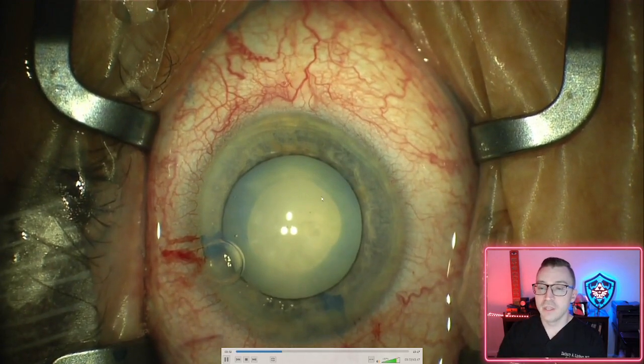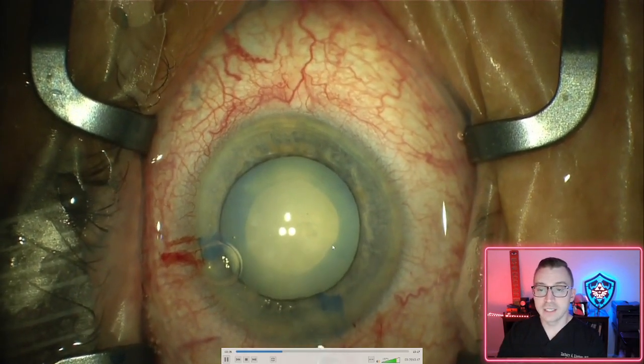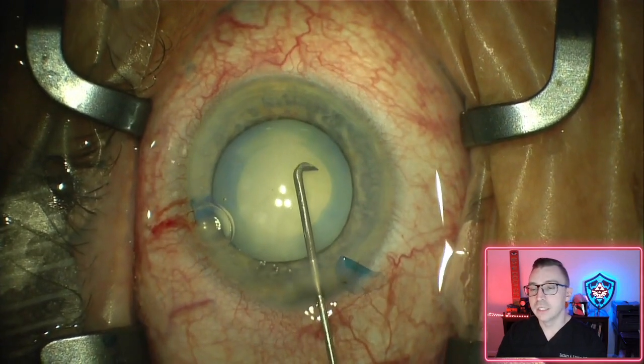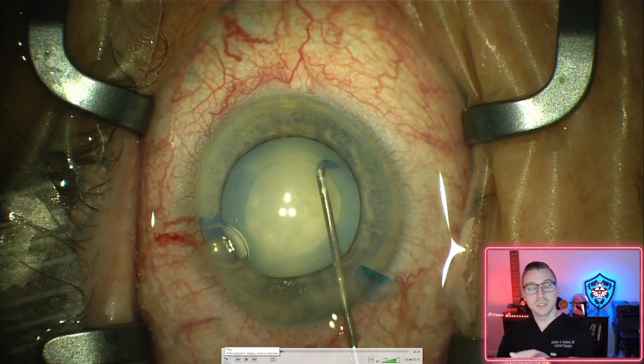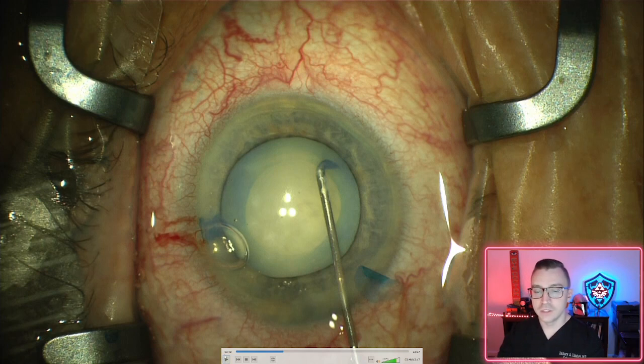So we can see here, this actually went really well. Capsule tore very nicely. There were no issues here at all, thankfully. I'm going to pause here. Sometimes if I can tell that it's under a lot of tension, I will make a tiny little incision there and then go through with an empty cannula and aspirate some of the cataract material out just to decompress it a little bit, to relieve some of that pressure before I actually start making the rest of that opening into the capsule itself. Just that decreases the risk somewhat of that capsule wanting to tear on you or run out on you or just go the way you don't want it to go.